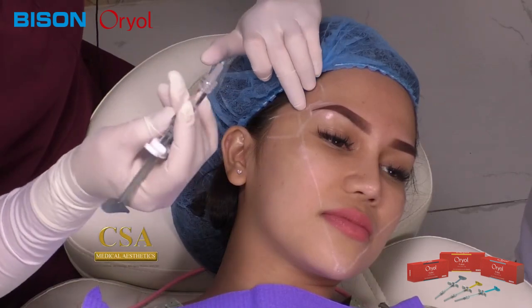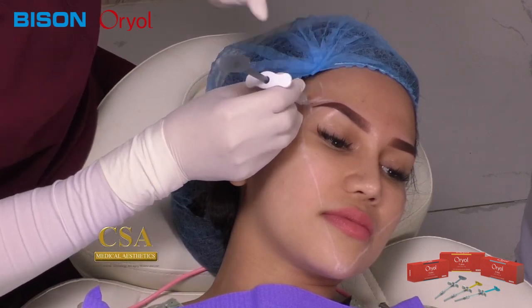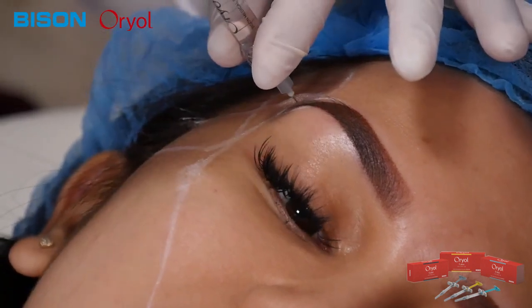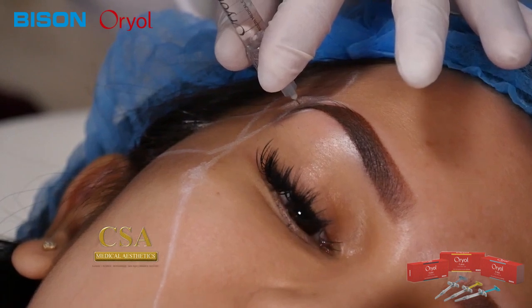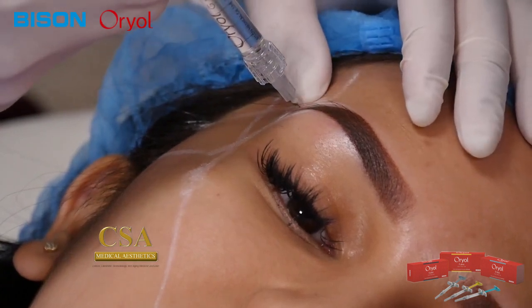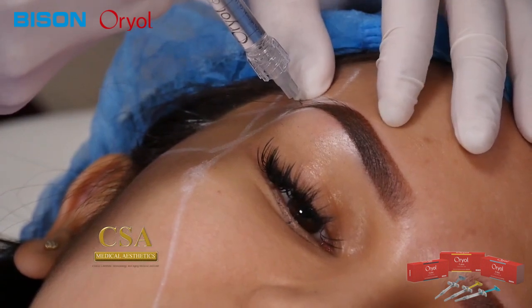Needle method, bolus approach. So here, I'll be injecting about 0.5 ml of my hyaluronic filler. Now, I am on the bone, so it's a perpendicular direction. I usually aspirate. It's my habit to aspirate and wait for a few seconds. Now, if there's a negative backflow, I start to push, and pushing is at a slow rate only. We're not in a rush, especially when you're doing the temple section.